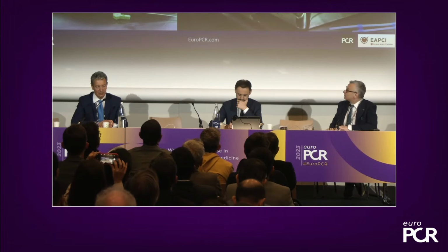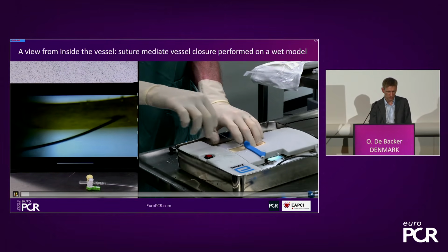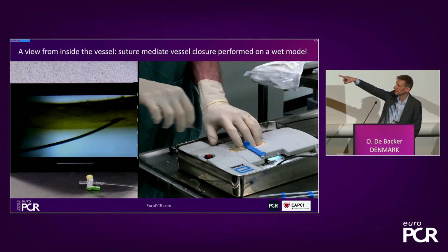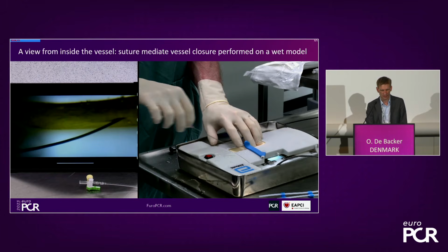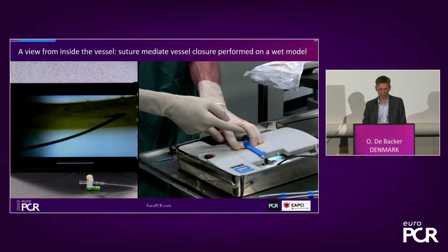Yeah. Why? Okay, so this is just the initial puncture. I will pause it for a couple of seconds just to explain what you see. That's just my hands on the simulator, but it's nice to look at the screen on the left. That gives you a view, of course, on this wet model from intravascular. So it shows you what happens inside the vessel, and that's nice. If you see this video, for those who are not very familiar with ProGlide ProStyle, you know exactly what's happening, what you're doing when you're deploying this ProStyle. So I hope this is just a 4-minute video. So this is the puncture again.